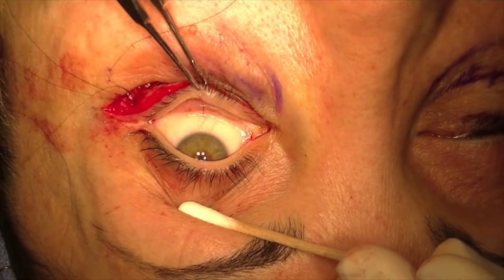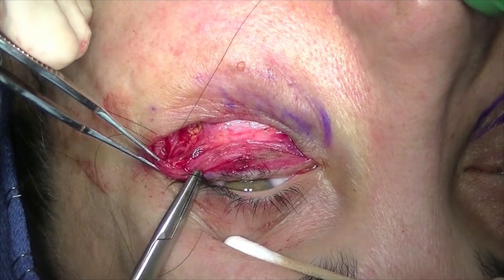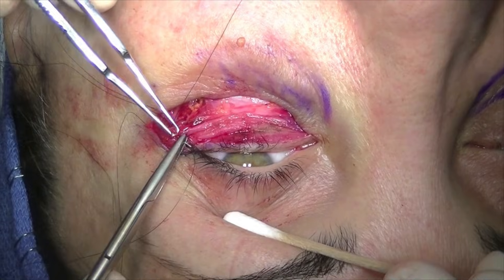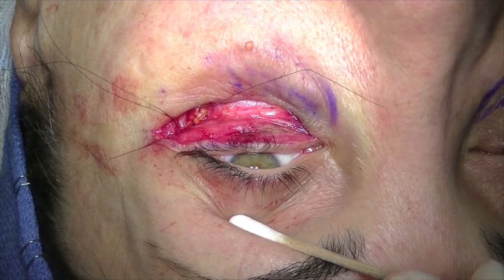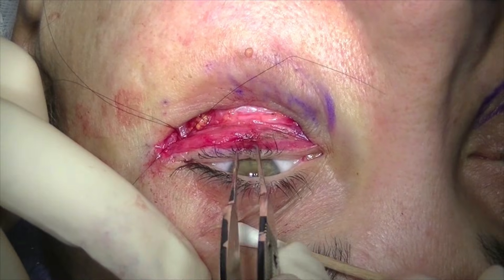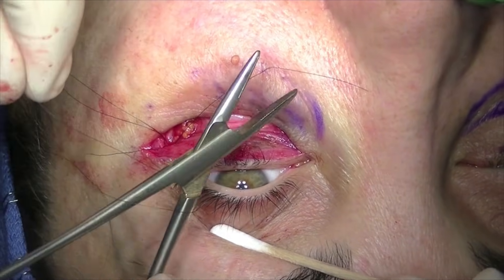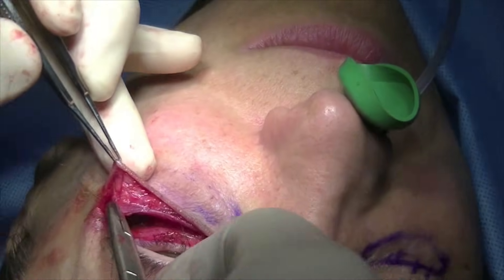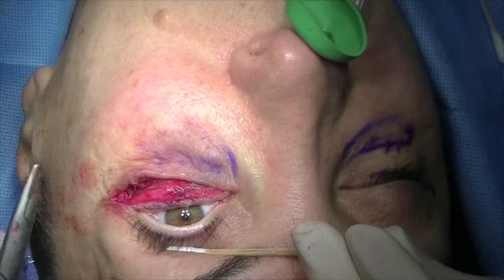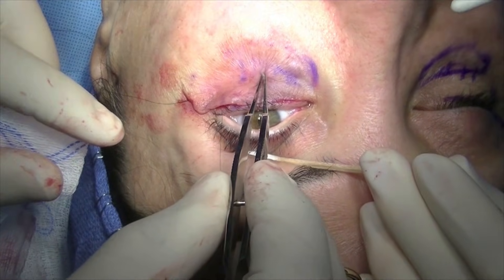I always perform a snap test at this point prior to suture placement. After placement of the suture through the lateral aspect of the tarsus, through the orbicularis muscle, and tightening it, the snap is actually improved significantly. I always stretch the lid margin superiorly to make sure it has not been over-tightened. The second periosteal suture is then placed through the skin-muscle flap and tightened to further support the lower lid margin.